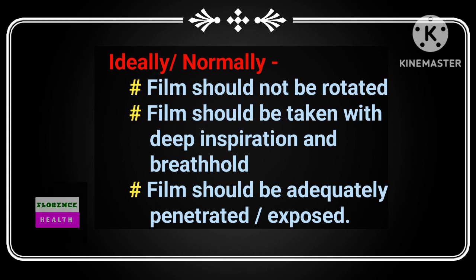Ideally, the film should not be rotated. The film should be taken with deep inspiration and breath hold. The film should be adequately penetrated or adequately exposed.